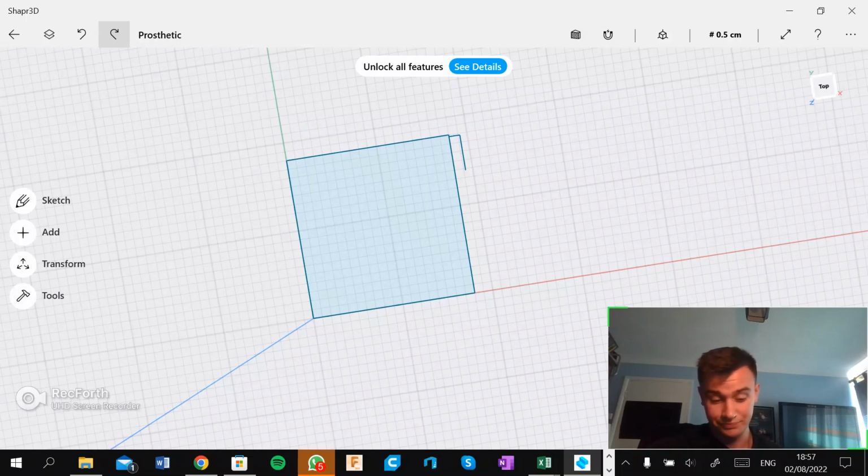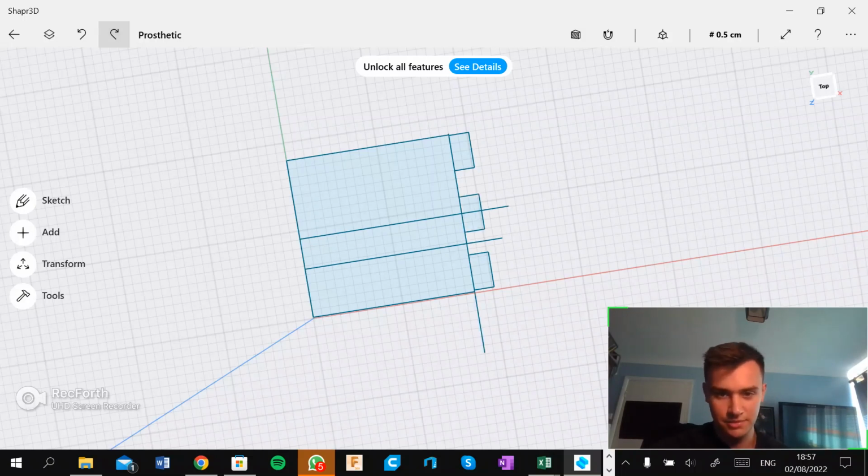So at first I decided to compartmentalize the fingers. So I was going for the base joint that would literally just all connect in there, and I could just add everything else on there, the joints for the knuckles. And so I mirrored it to try and make it as accurate as possible. And then you just see me doing it again with this there.